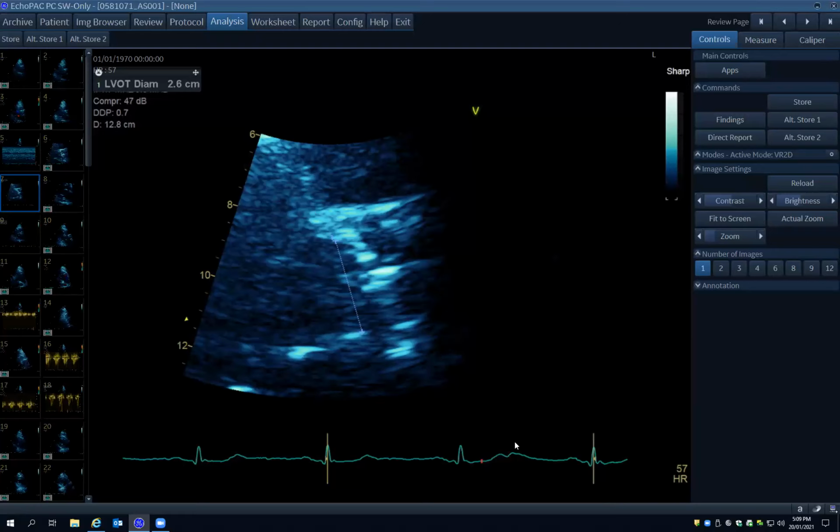So those are other tricks. And you do that with transthoracic 3D? With transthoracic 3D, and what you can do is at the tip of the aortic valve, putting it through, you can actually planimeter the aortic valve, knowing you're right at the tip. But again, you've got to have decent looking, good quality images in order to be able to do that.